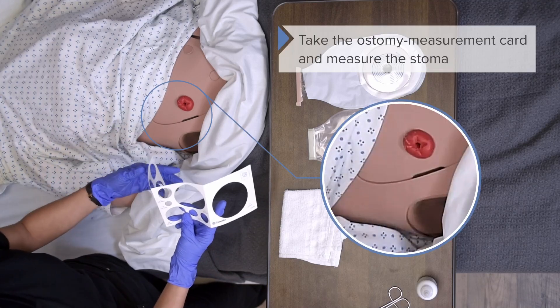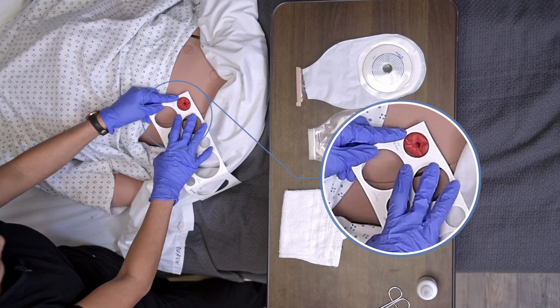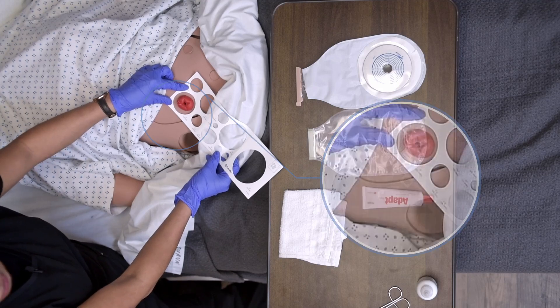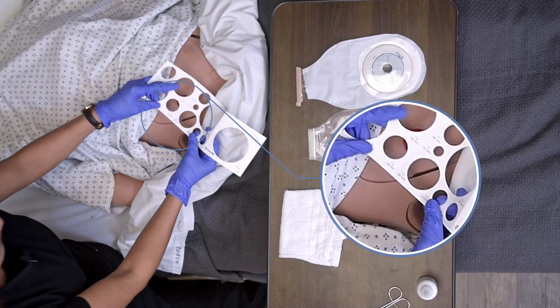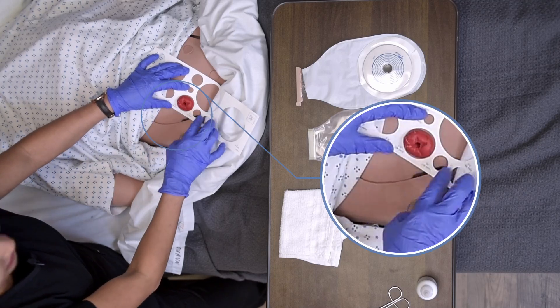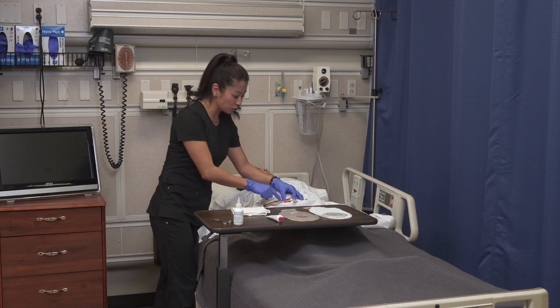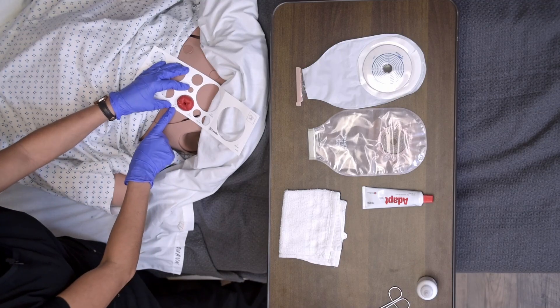We simply place the measuring device over the stoma itself. At 32 millimeters, you can see that doesn't even go around the stoma — that would be way too tight. At 50 millimeters, that's definitely way too big with too much gap. What you want to see is that it fits nicely with as minimal open area as possible. The 38 millimeter size looks like a really good fit — see how it hugs nicely around the stoma. Stomas can vary in size and shape, but this is really nicely snug with just a little bit of room and not too tight. So for our patient, we'll be using the 38 millimeter measurement.